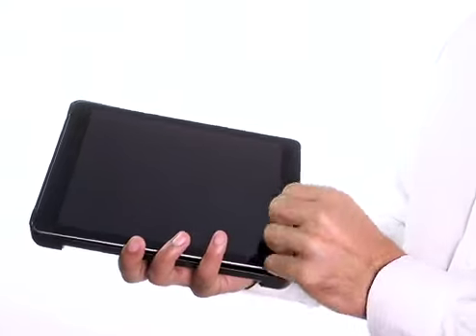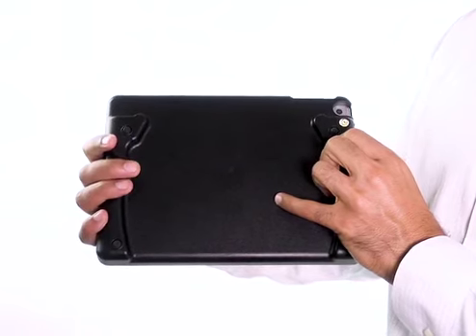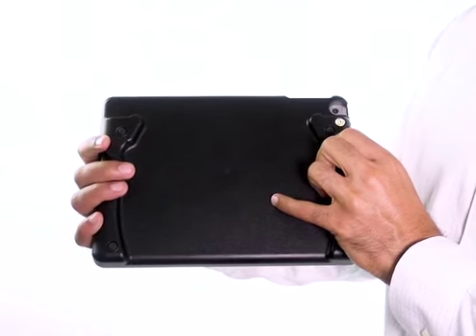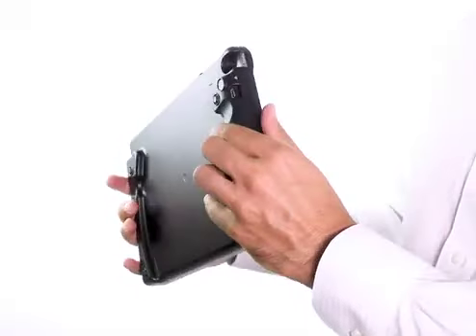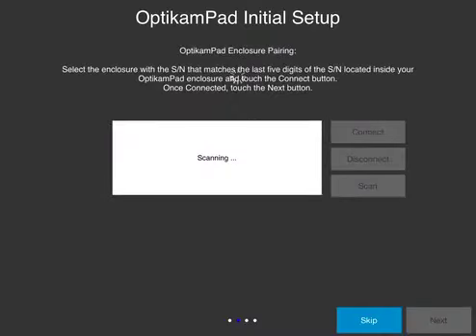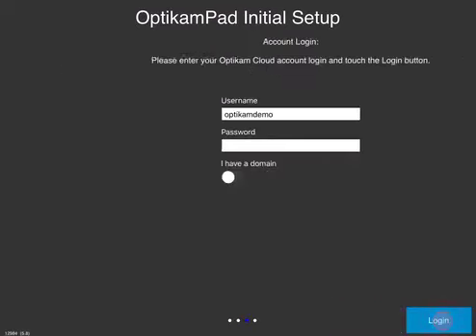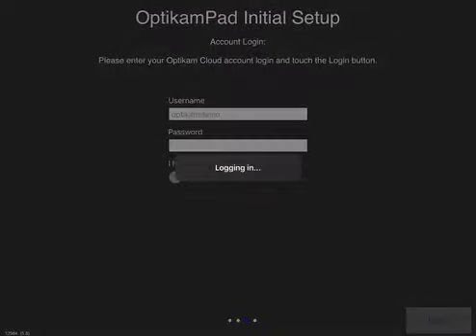If you have a non-iPad Pro, snap the iPad into the flash enclosure and ensure that it's charged. The enclosure is charged separately from the iPad using the provided USB cable. After launching the app, follow the initial setup wizard to pair the flash enclosure for non-iPad Pro tablets. Enter your app login and tap the Finish button to begin.